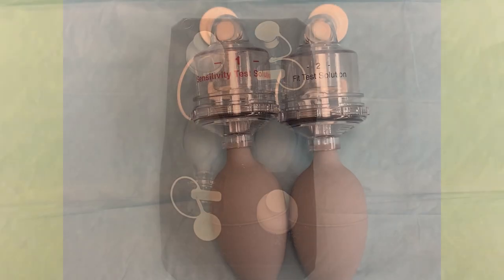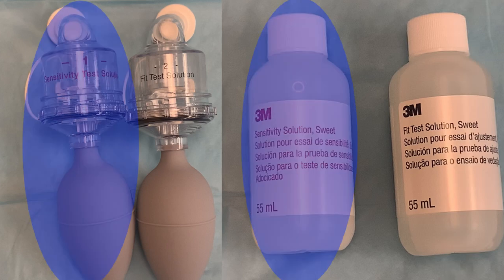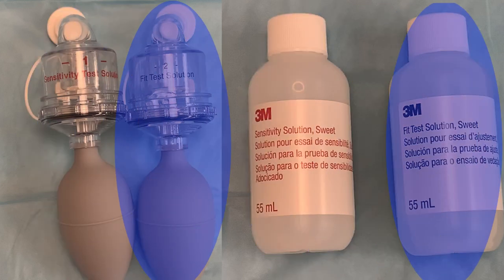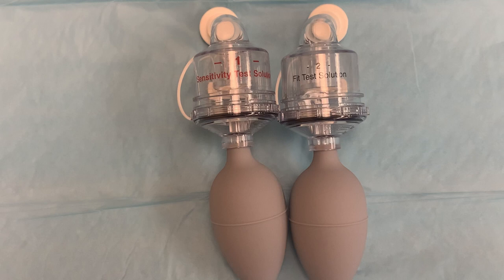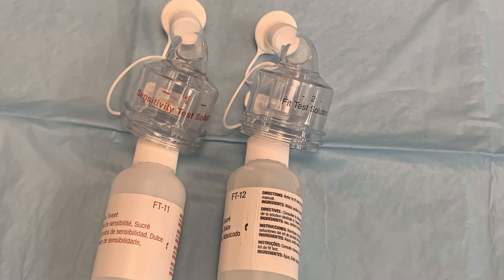There are two nebulizers needed for every fit test. One will hold the red sensitivity solution and the other will hold the black fit test solution. Both nebulizers are identical in function — the only difference is the labeling on the lids. One has a red "1 sensitivity test solution" label and the other has a black "2 fit test solution" label. Both nebulizers will work with either solution, but match the lids with the respective solution to help you keep track of your nebulizers.